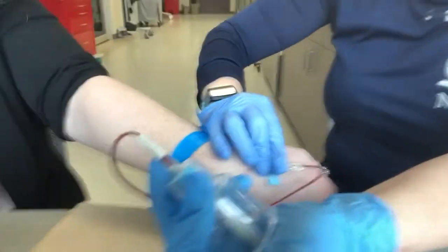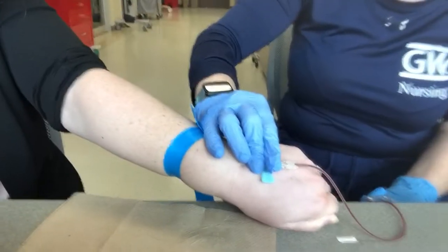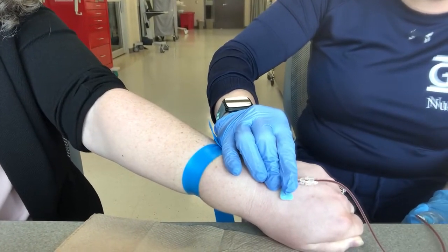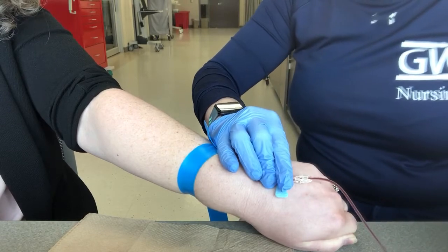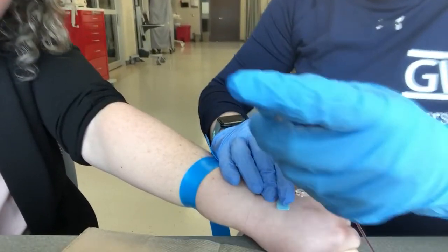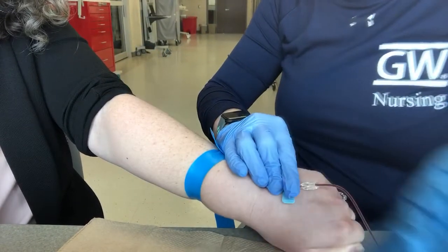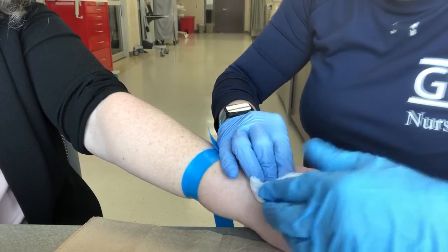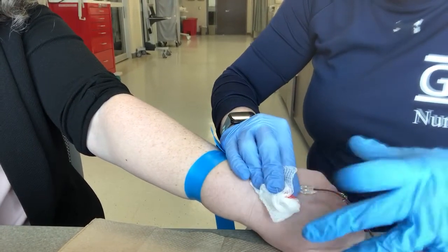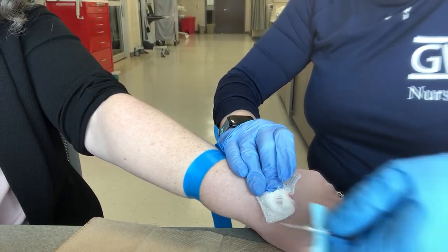Thankfully that was actually working really well, so it is filling up. You have to kind of let gravity do its thing a little bit. Now that we have our tubing, don't shake this — just kind of tilt and set it down, then slightly mix it by turning it over evenly. Go ahead and apply your pressure, and then you are done.